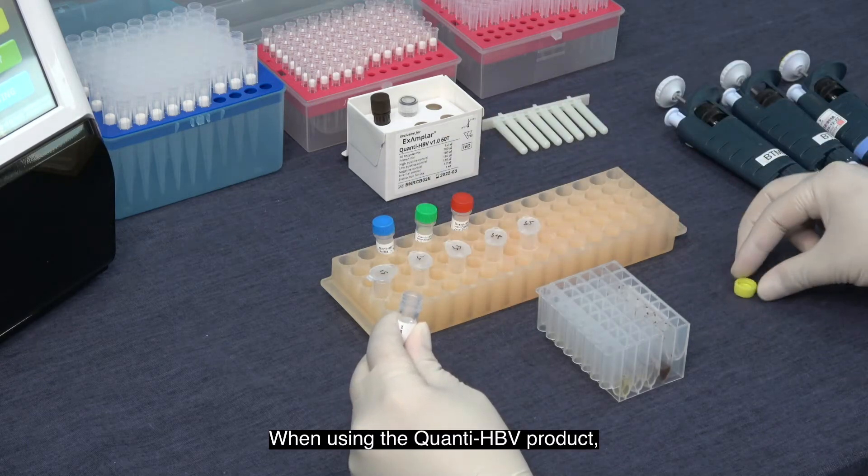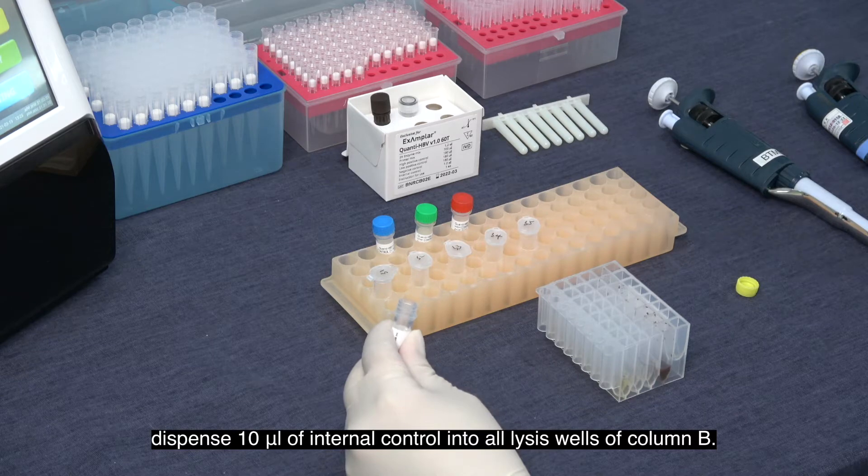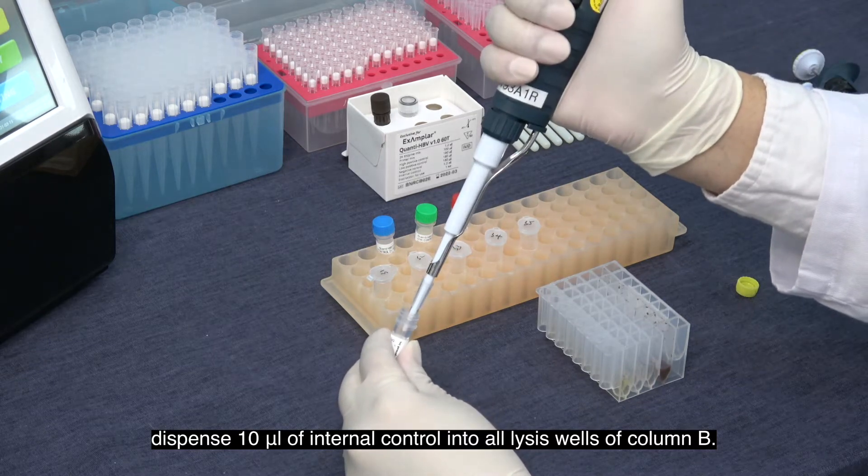When using the Quanti HBV product, dispense 10 microliters of internal control into all the lysis wells of column B.